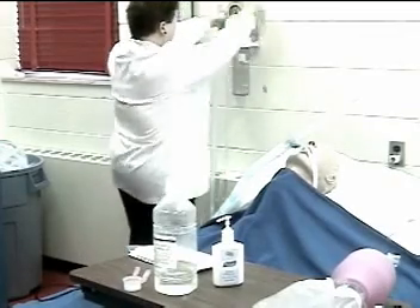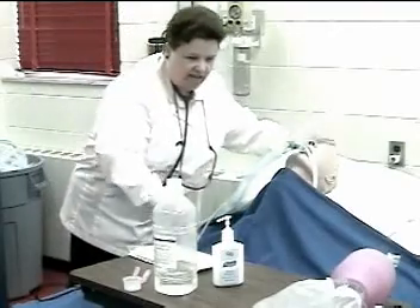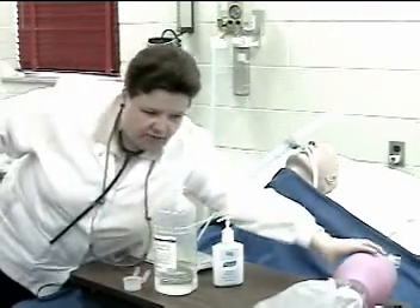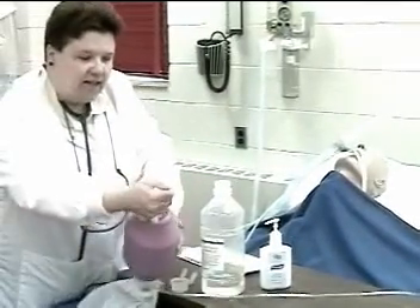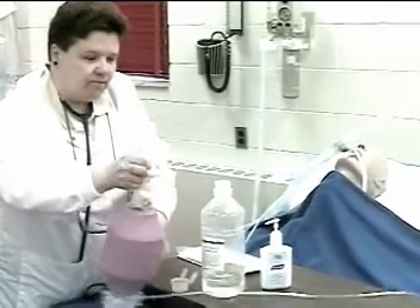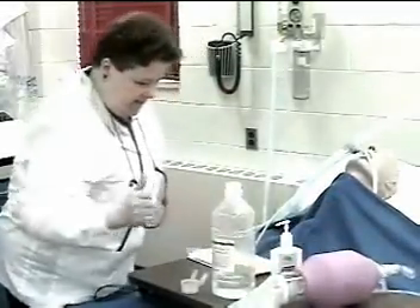Assembles and checks equipment for function. I have it set at negative 120, and I'm going to check the resuscitation bag with a disposable glove to assure that the bag is functioning. It's set at 15 liters per minute.